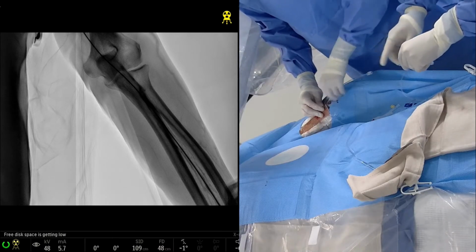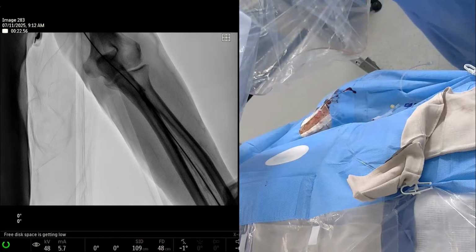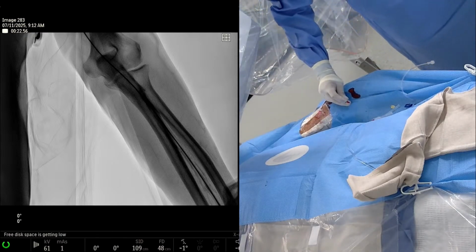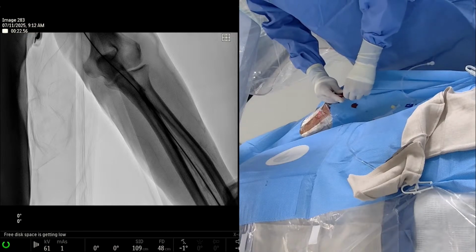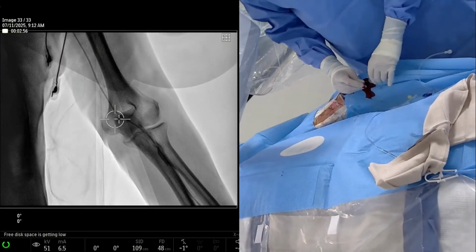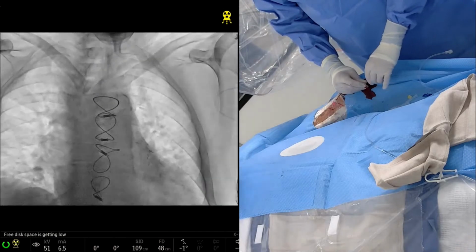Yeah. So, and then what you do is once you get across with the glide cath, you usually can stop there. You'll put a stiff wire, and you can actually pop it straight. Now, some patients won't tolerate it. So you'll have to give either extra pain medicine or an extra cocktail, just because it causes a lot of spasm. But in this case, he'll tolerate it fine.